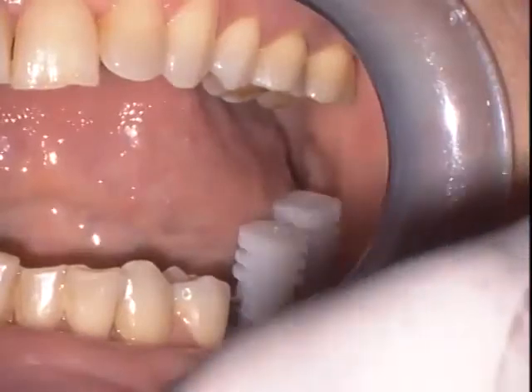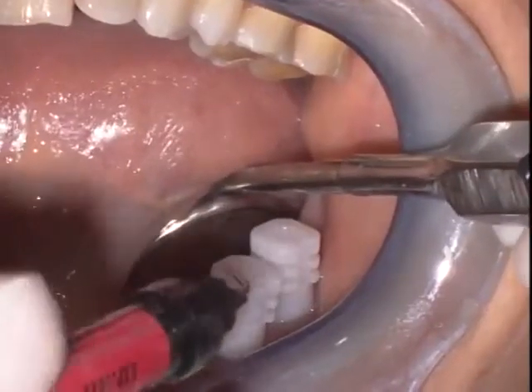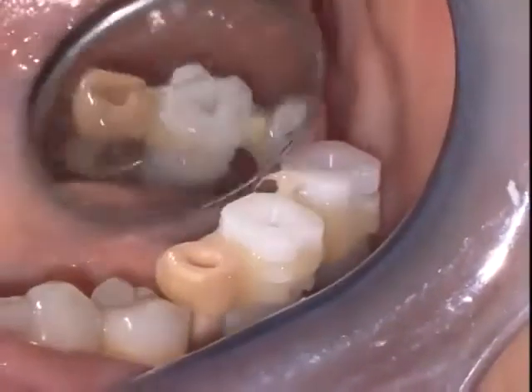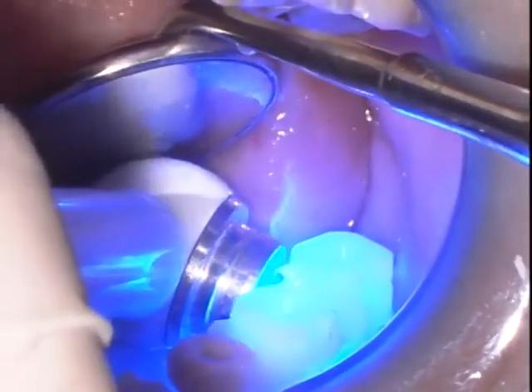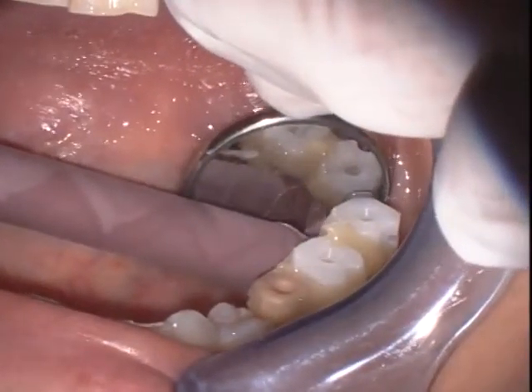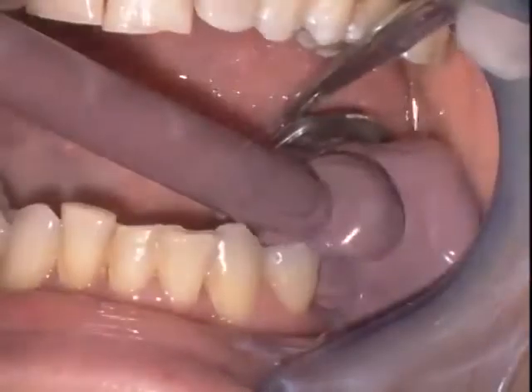At approximately 2 months, David Garber went ahead, and with a healed tissue now to work with, he went ahead and utilized snap caps over the permanent abutments, which have never been removed from the case. And in order to develop accuracy and to have no distortion with utilizing multiple snap caps, he likes to splint them utilizing a flowable composite resin material. This flowable composite resin simply secures the 3 snap caps so that they will not be able to be moved in the impression, and this maximizes the predictability of the restorative phase.